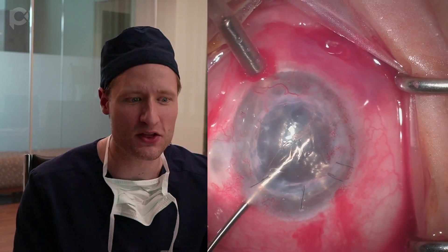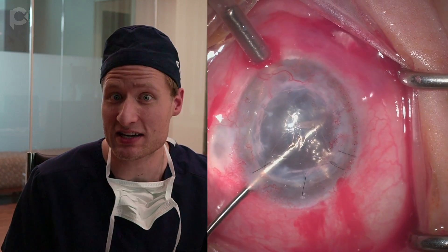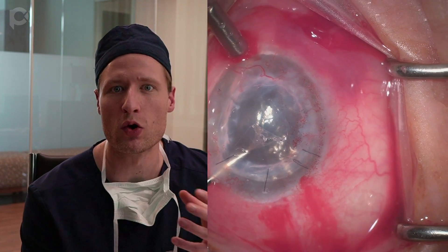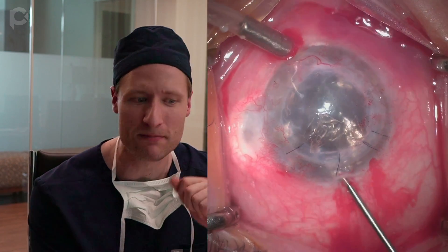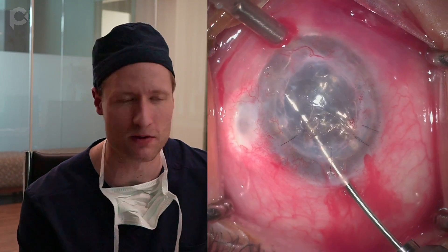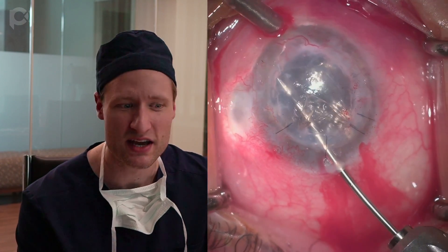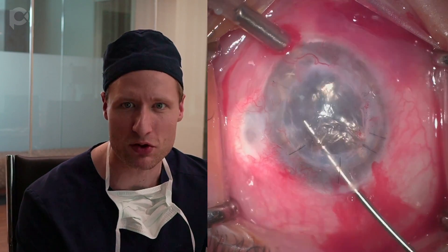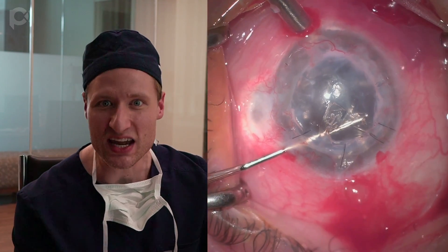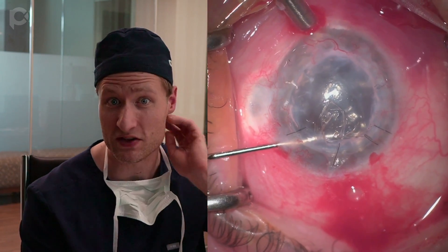I grab this fibrotic Descemet's membrane with coaxial MST forceps. I like these forceps because they allow me to go around and pick at these little tags of Descemet's membrane incorporated into the interface that you'll never get just by picking with the inverted Sinskey hook alone or even the Melles scraper alone. This for me is the most meticulous part of the operation — going around and removing all of these remnant shreds of fibrotic thickened Descemet's membrane.